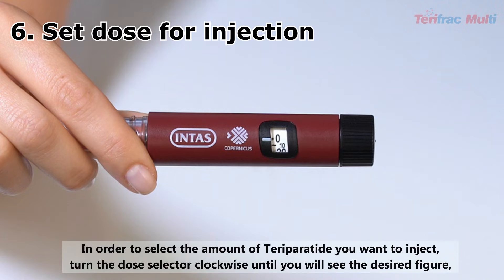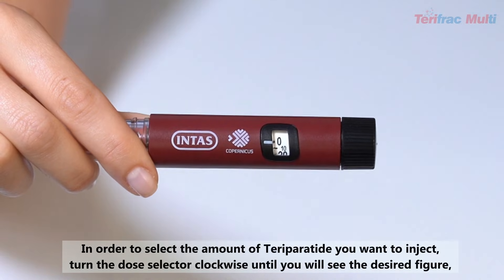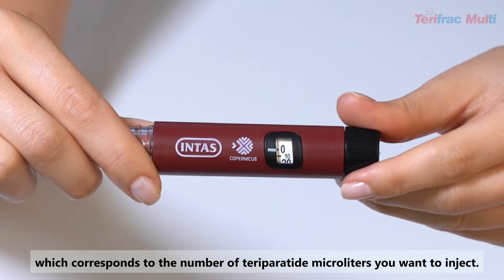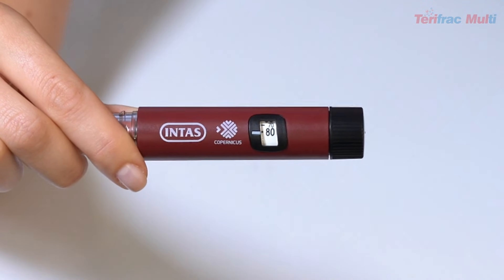Set dose for injection: In order to select the amount of Teriparatide you want to inject, turn the dose selector clockwise until you see the desired figure, which corresponds to the number of Teriparatide microliters you want to inject.